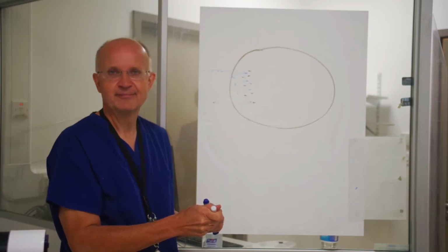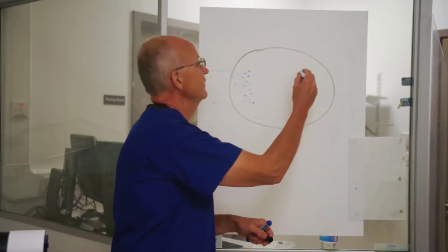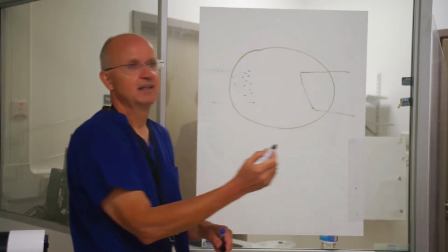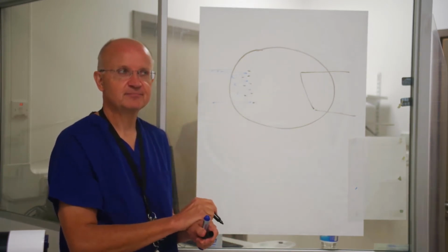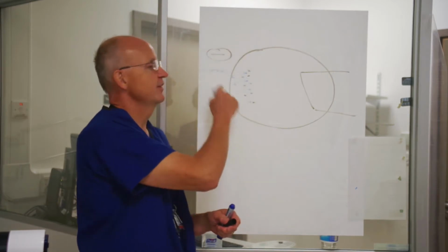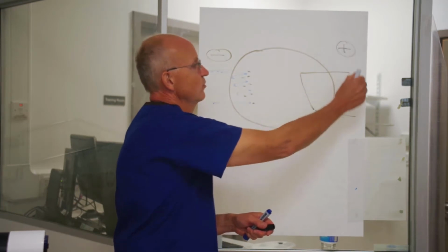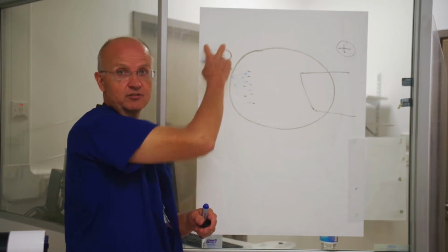The target. A target. In an anode. Aha. Now we have an anode. What's an anode? Well, it's a copper block. We'll come back to that in a moment, Sarah, but what is an anode? And what else do you have to have if you have an anode? You've got to have a cathode, have you not? Yes, so that's the filament. So the filament forms the cathode, and the anode is over the other side. So we've got one which is going to be positively charged, that's why it's called the anode, and the other one is going to be negatively charged, that's why it's called the cathode.